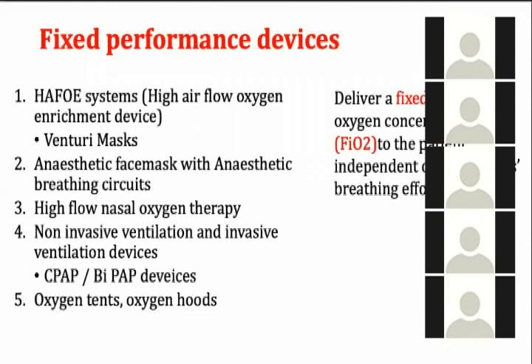Understood, Pavita? So at the peak inspiratory rate, just say 25 liters per minute, the patient needs to take 25 liters for the moment, and 5 are being given as pure oxygen. The rest 20 should come from the air, which is called entrainment, and that air contains only about 20% oxygen.